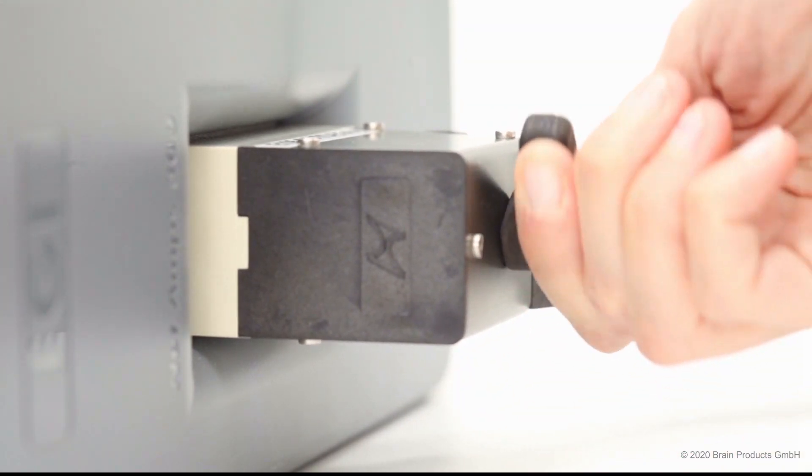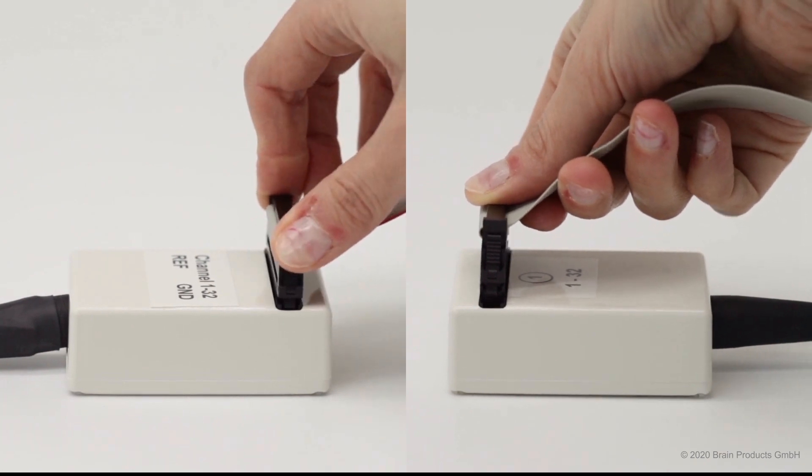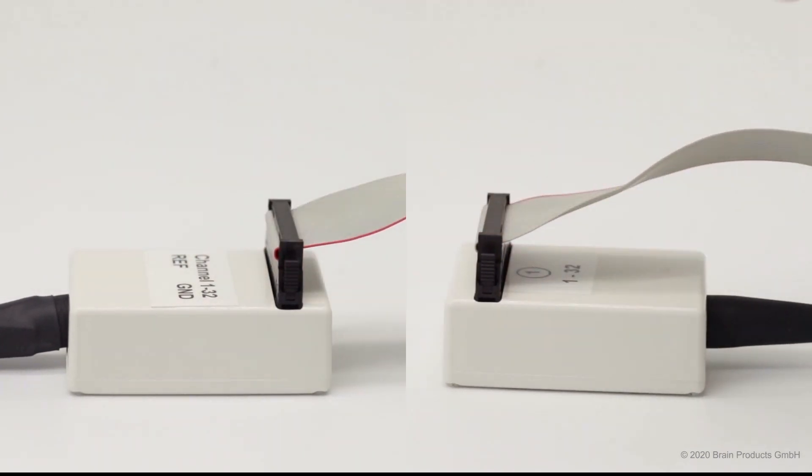One end plugs directly into the Net Amp, whereas the other end connects to the cap via ribbon cables, of which different lengths are available.